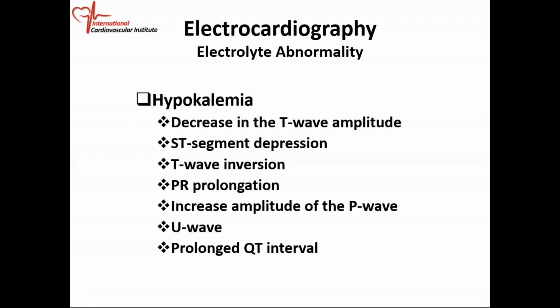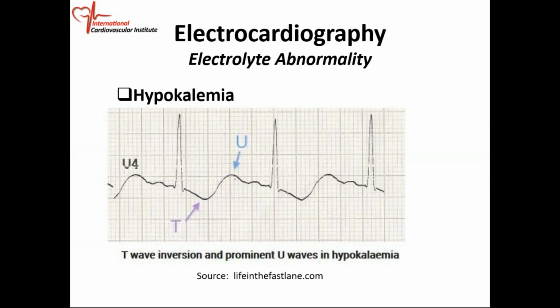And the ventricular tachycardia, we call it polymorphic ventricular tachycardia. Polymorphic because it's more than one form. The other term for it is torsade de pointes. These patients can degenerate into ventricular fibrillation. So again, with a low potassium, hypokalemia, you get these inverted T waves and these U waves. The wave that comes after the T wave is a U wave. So you get these big U waves.